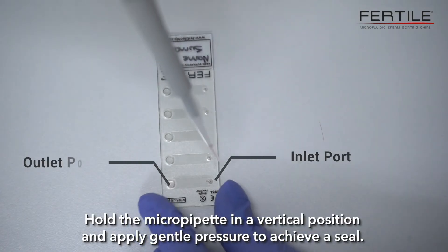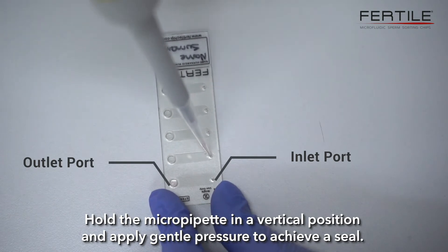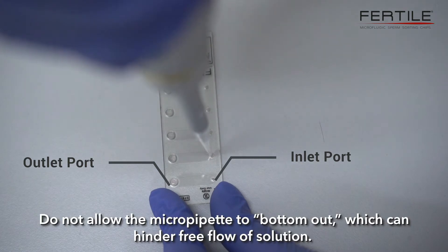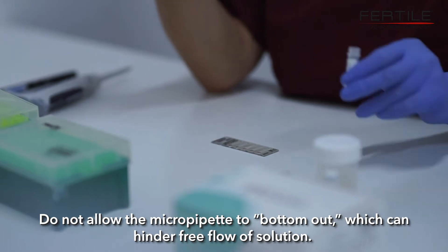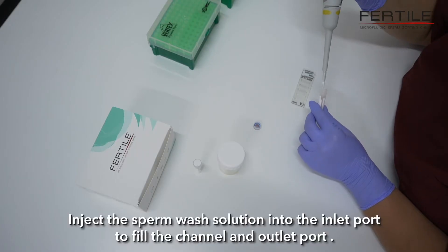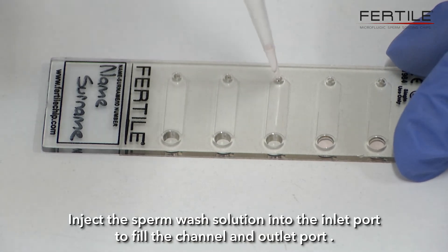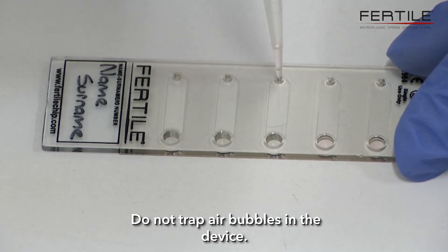Hold the micropipette in a vertical position and apply gentle pressure to achieve a seal. Do not allow the micropipette to bottom out, which can hinder free flow of solution. Inject the sperm wash solution into the inlet port to fill the channel and outlet port. Do not trap air bubbles in the device.